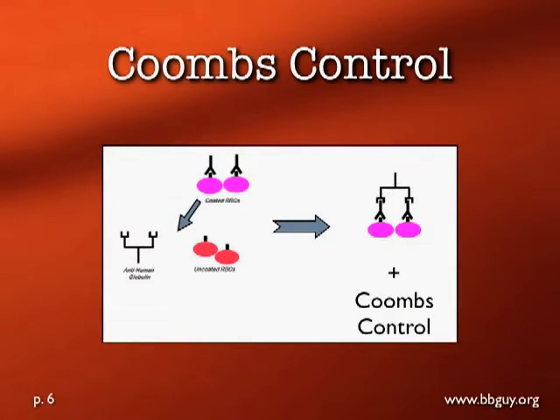If anti-human globulin is there and working, you should see a visible agglutination. You don't have to do this for a test like gel because the plasma doesn't actually go through the gel system with the red cells, but certainly you have to do it for tube testing.